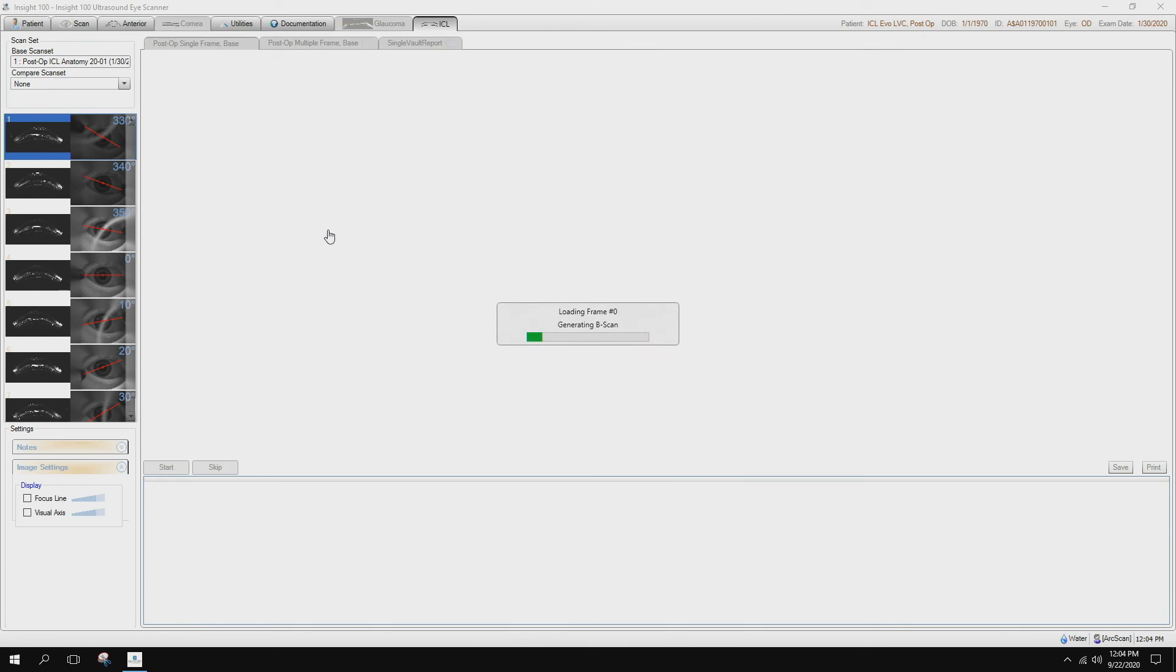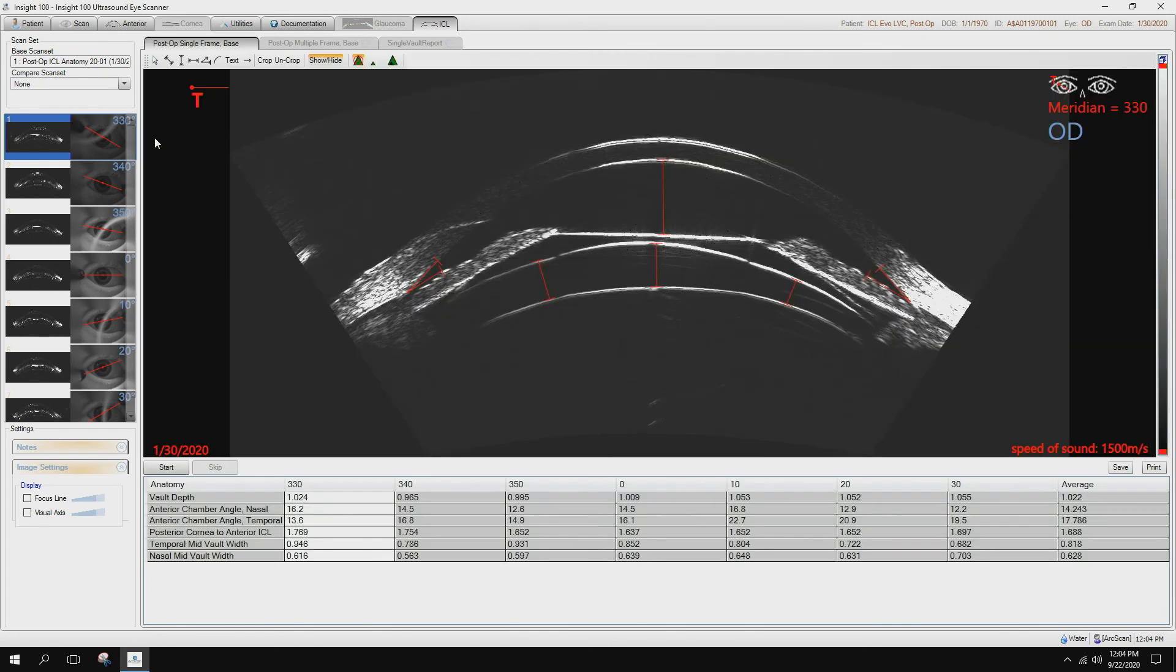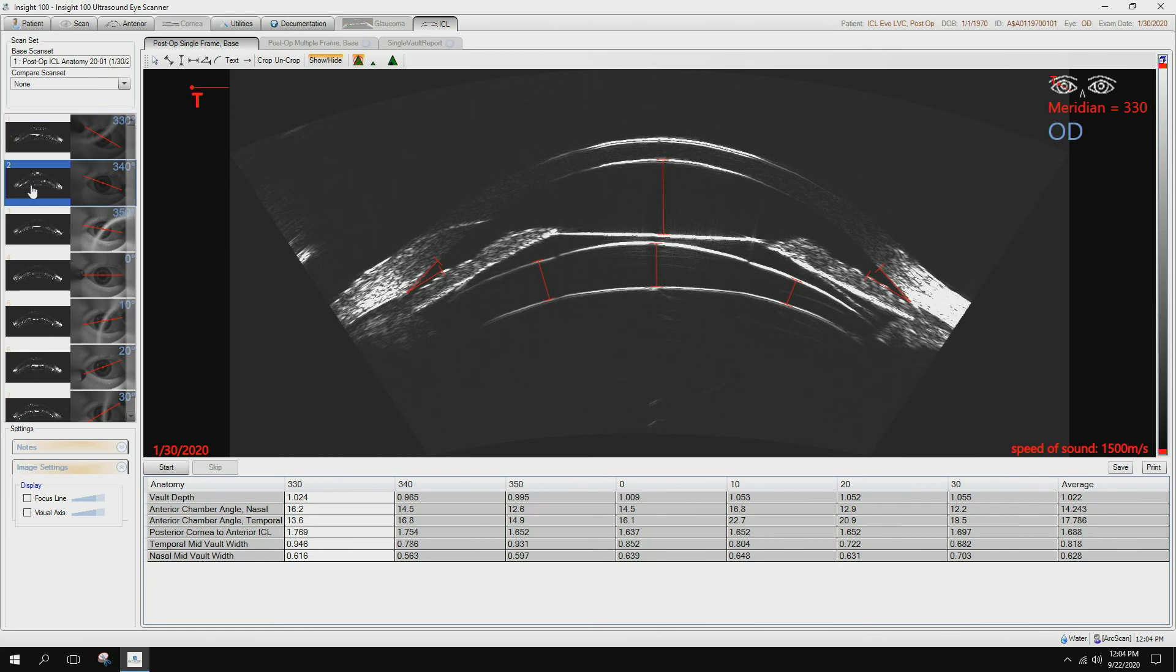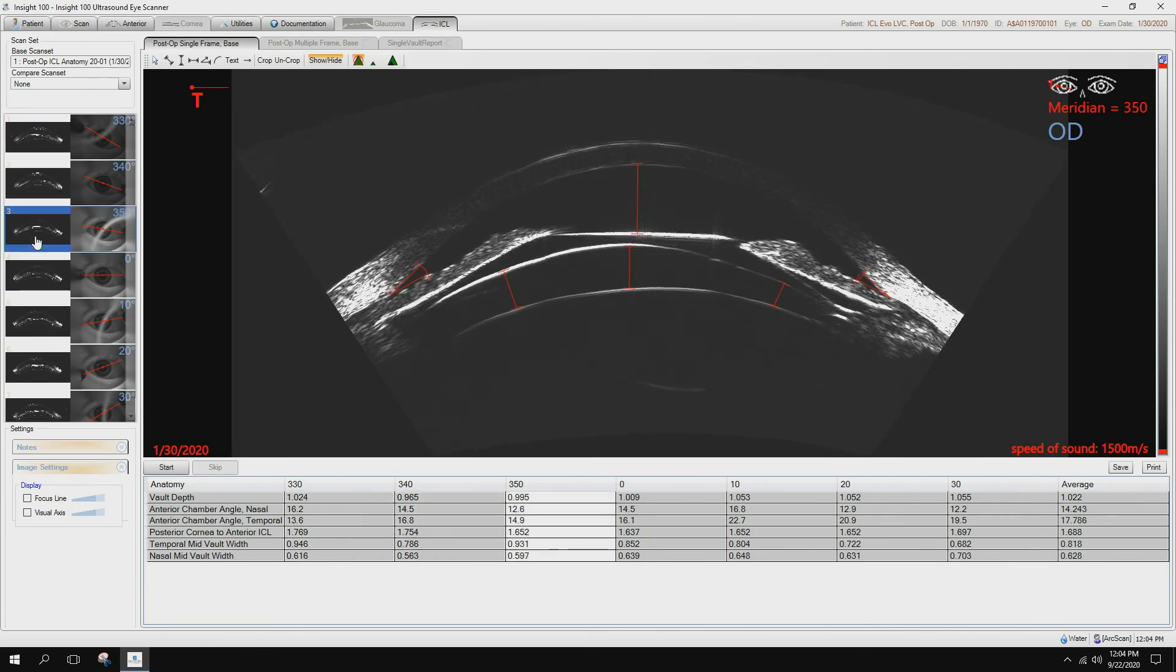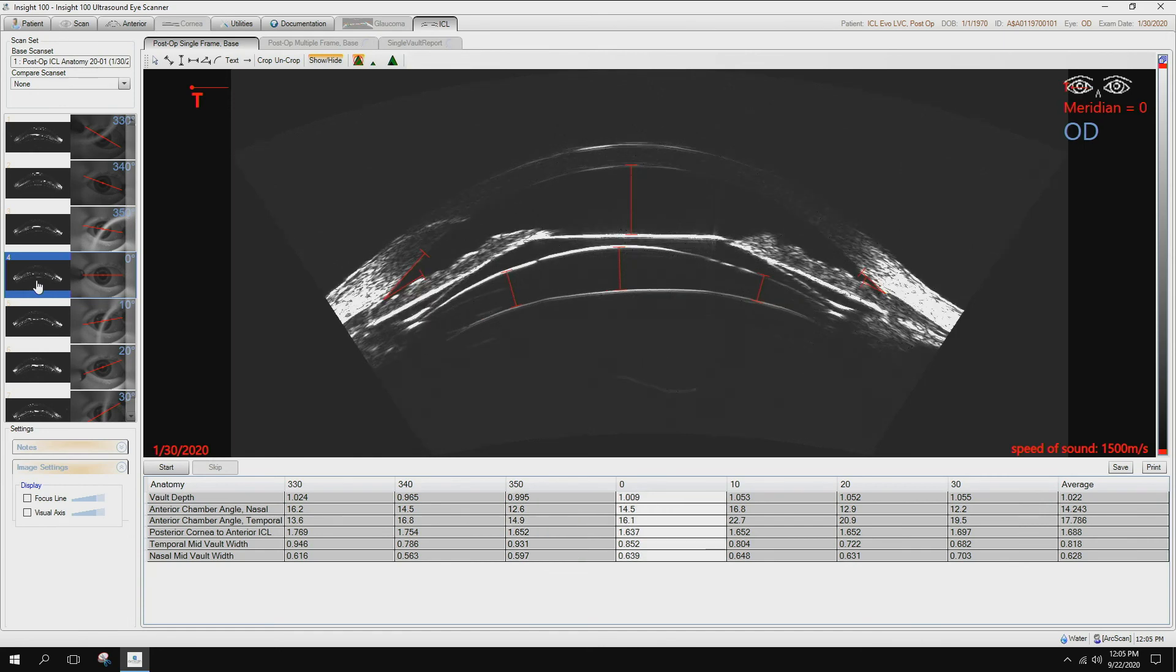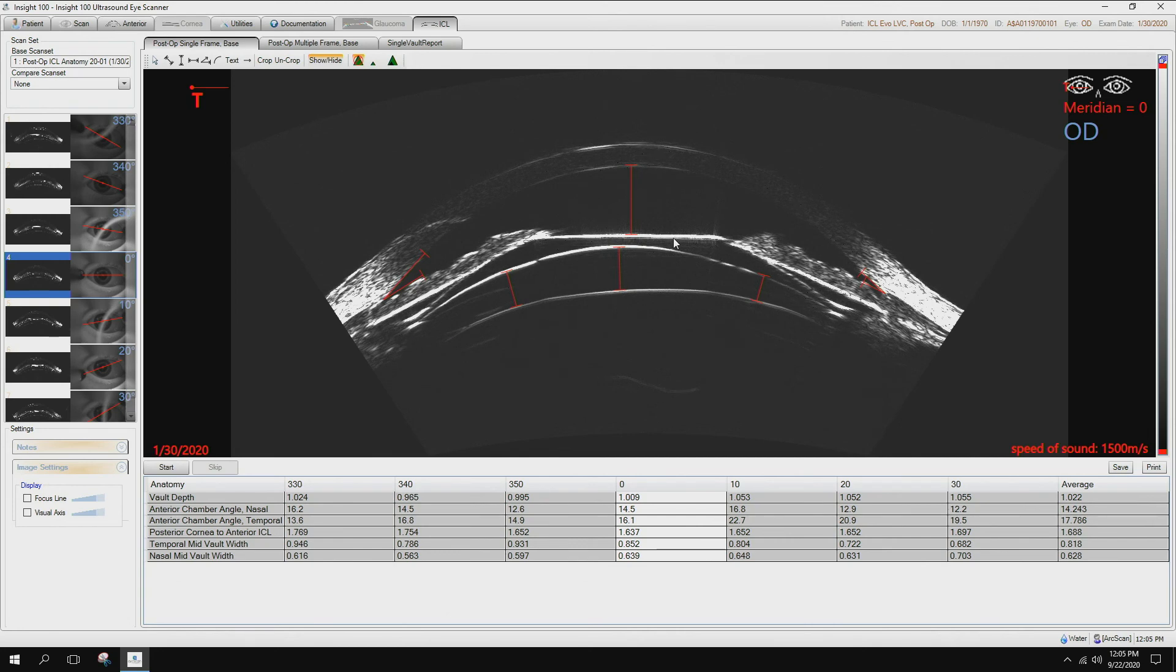Again, we've taken multiple meridians. The multiple meridians are so that we can visualize where the footplate of the lens is. So as I look through the various images here, you can clearly see the footplate here on the ciliary body, here's the footplate over here on the ciliary body, posterior of the ICL, anterior surface of the ICL.